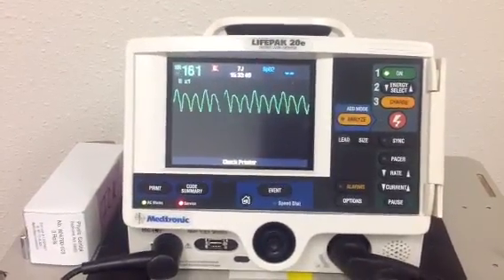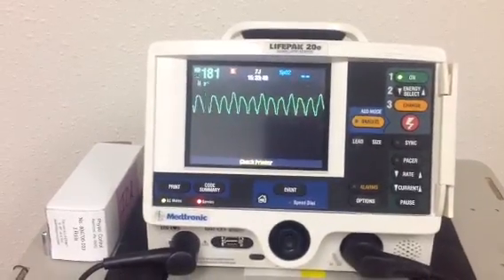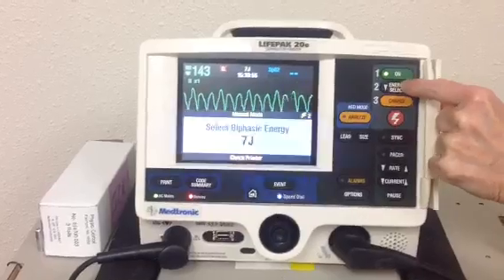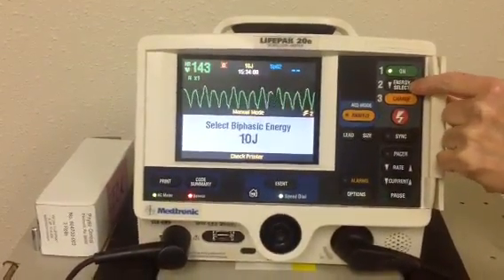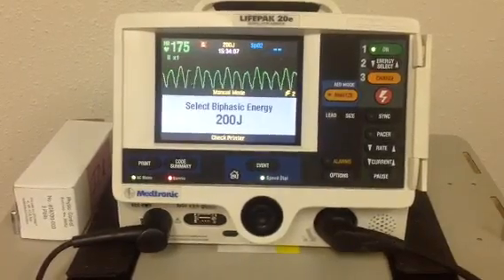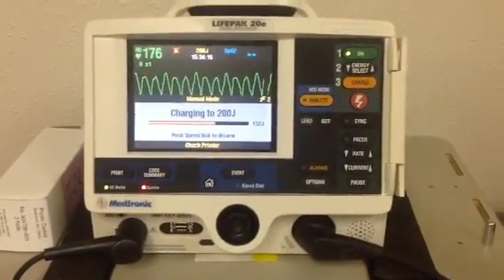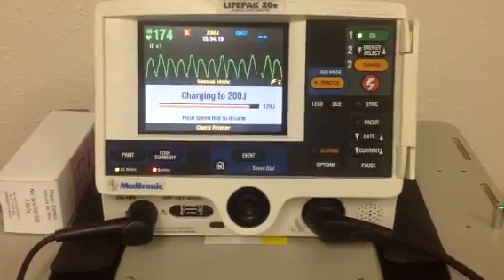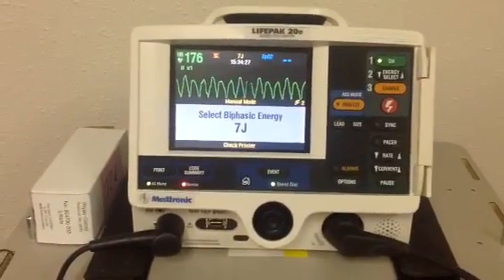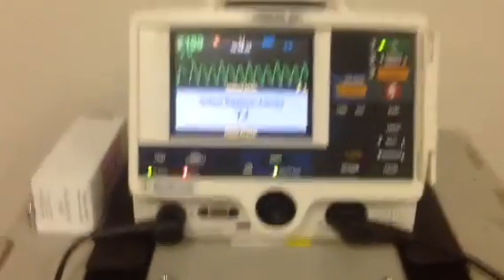If he did not have a pulse, then we would defibrillate — and we'll show you how to do that. It's actually simpler. To defibrillate, we now know our patient does not have a pulse. We're going to select the energy, and for defibrillation, if we don't know what kind of energy our defibrillator takes, we're going to start at 200 joules. We're going to charge. One, I'm clear; two, you're clear; three, everybody clear. And that is defibrillation.